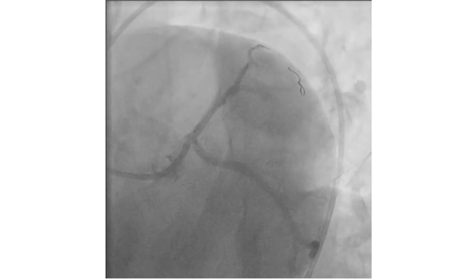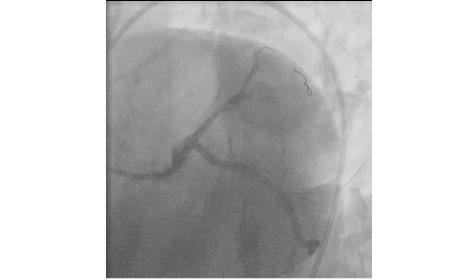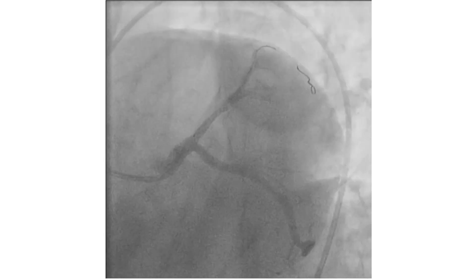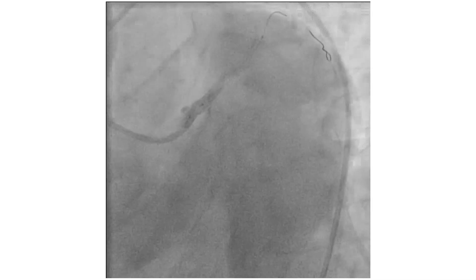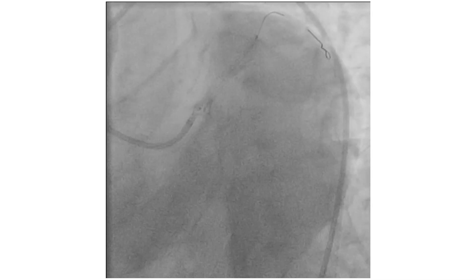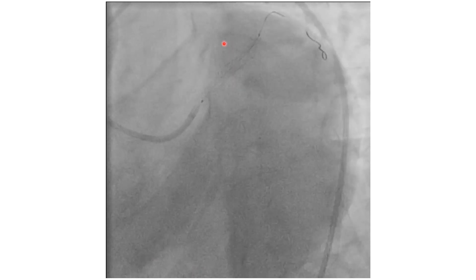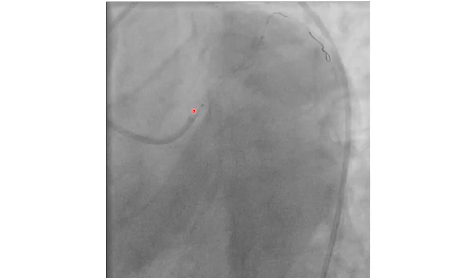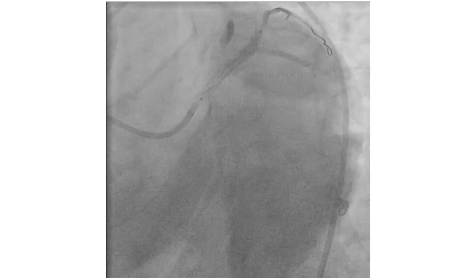Here the operator is trying to position a stent — direct stenting — starting from the ostium of the LAD. This is a spider view. The result of the stenting shows another vessel appearing, which is the proper LAD. And the stent was actually deployed in the diagonal.